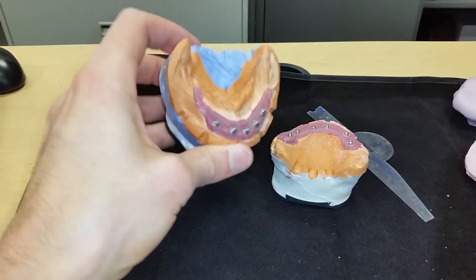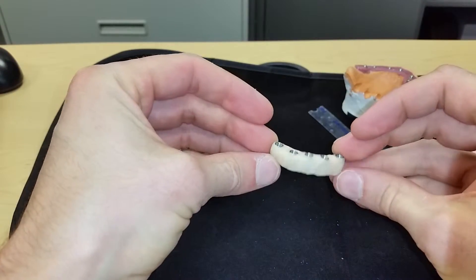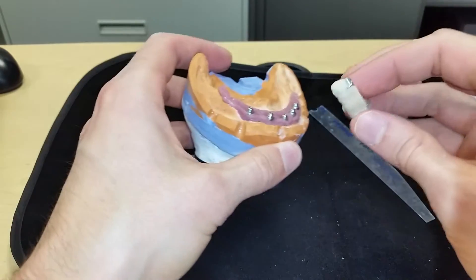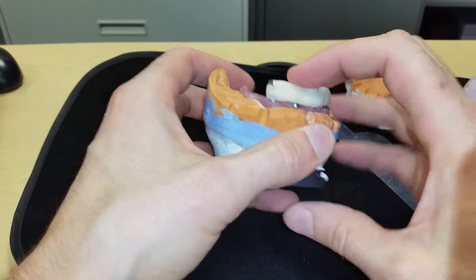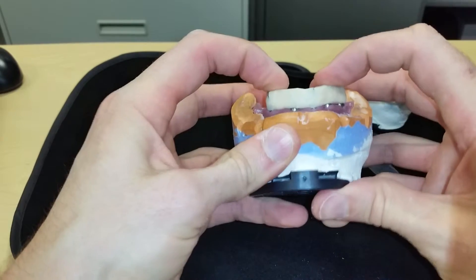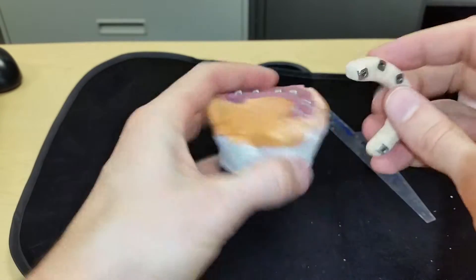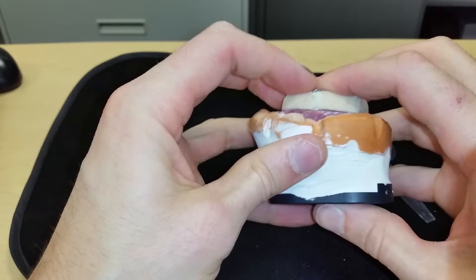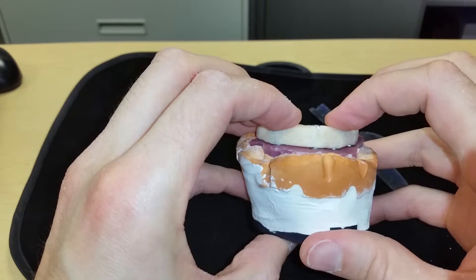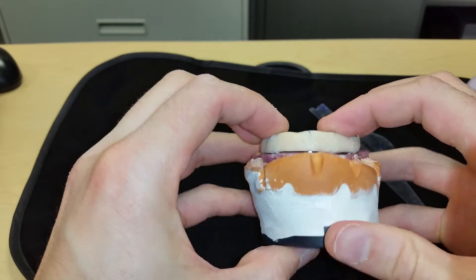Once I get to this point, I like to make a verification jig. This is just impression copings — I use some floss and some acrylic polymethylmethacrylate to bind everything together. I make it in the lab in segments to account for the contraction and shrinkage of the acrylic, then try it in the mouth to make sure it matches what's on the patient with no rocking. On the maxillary cast there was some rocking, so I cut it right down the middle and reapply acrylic intraorally using the salt-and-pepper technique to make sure there's no wobble. Then I can get it scanned and copied.